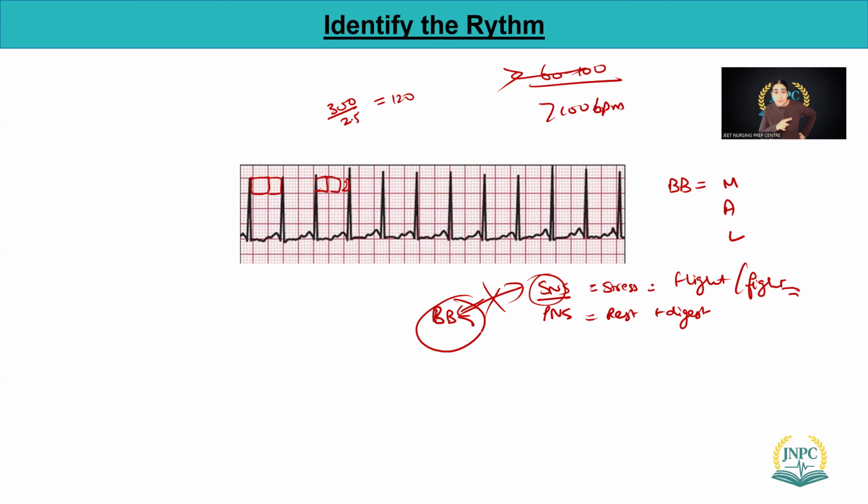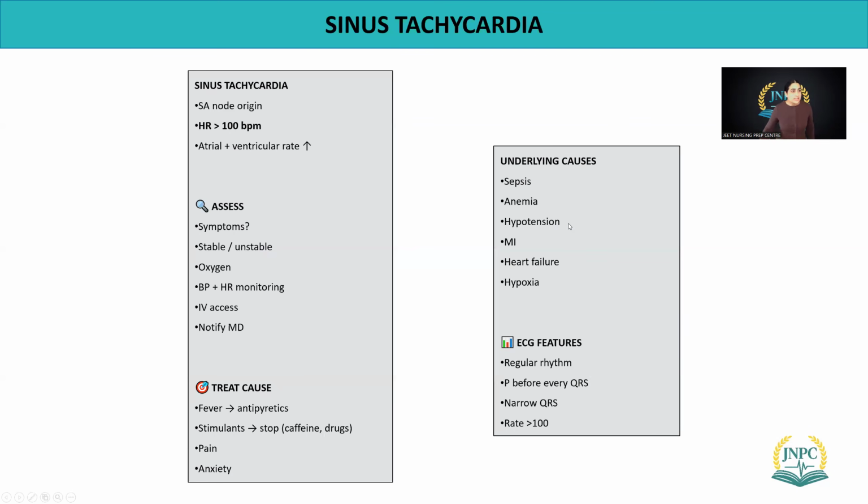I hope that you remember this lion example every time you think about the sympathetic nervous system. All right, so we will try not to give those drugs to those patients. Okay, so next is sinus tachycardia. I think we have done that. What kind of treatment do we need here? Sinus tachycardia.